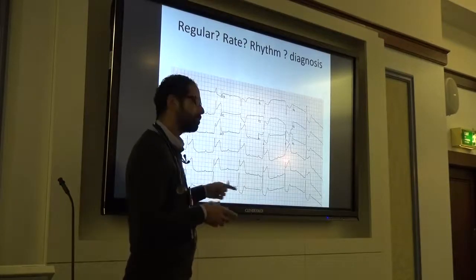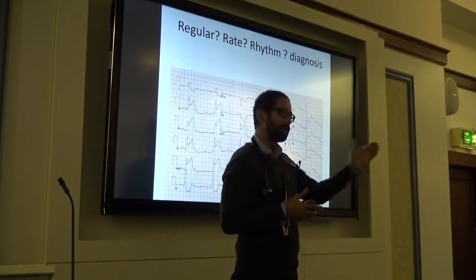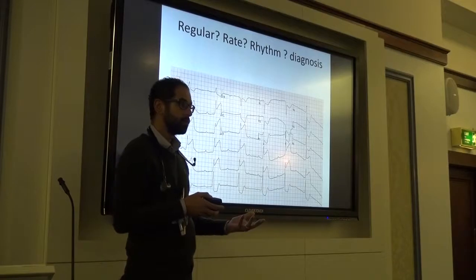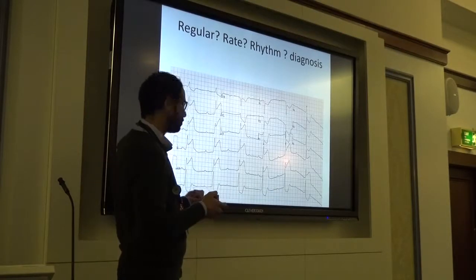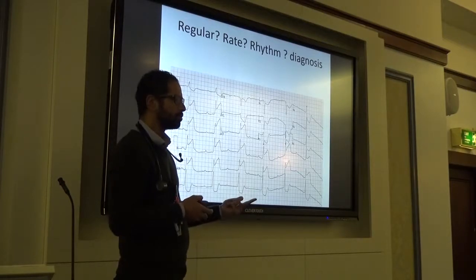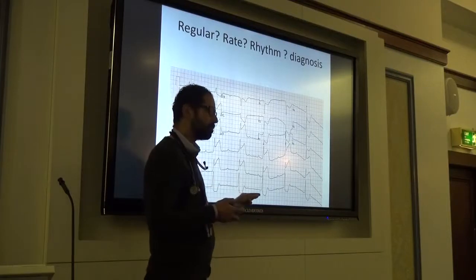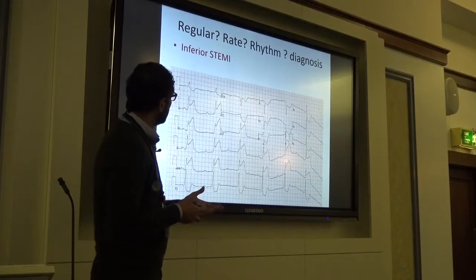So what could possibly be happening here? So we said it's not in the sinus node. It's in the communication between the sinus and the ventricle, between the atria and the ventricles, yeah? So it's something in the AV node. And if it's something in the AV node, then it's going to be either first degree heart block. Doesn't look like a first degree heart block here. 2 to 1 heart block. It's not keeping this regular nice boom boom tap pattern. Yeah? So it can only be complete heart block. Okay? Right.